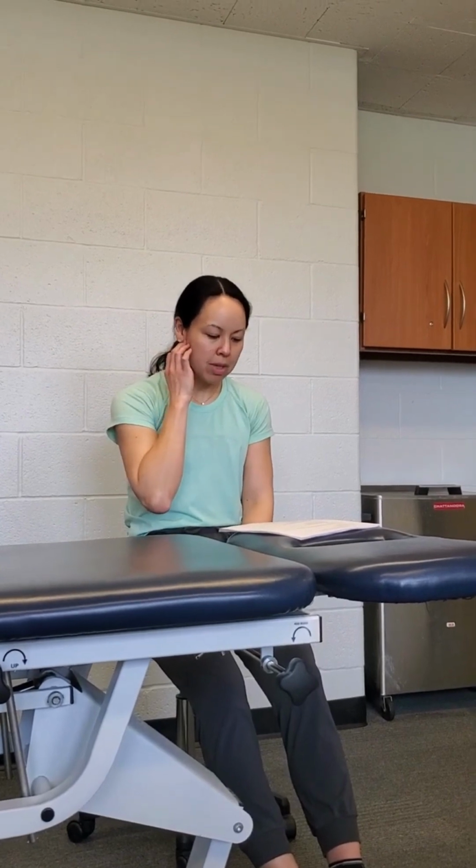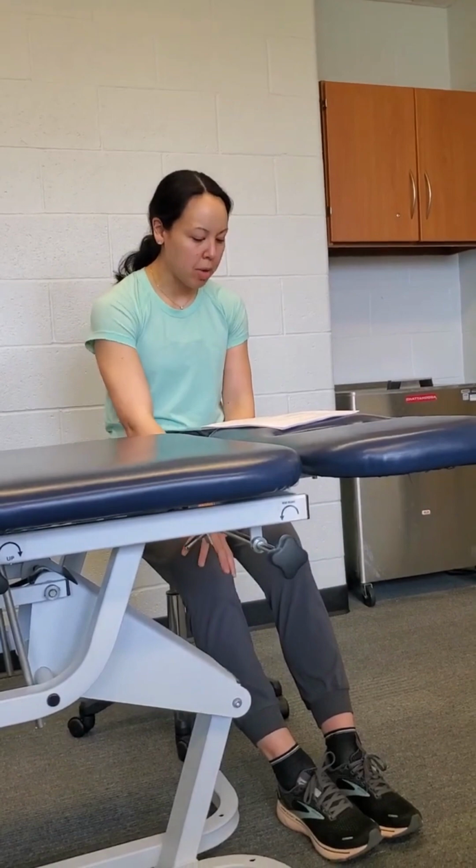For muscle strength and hypertrophy, so we're going to talk about what you are trying to achieve with using the BFR. For lower extremities, the limb occlusion pressure is going to be between 60 and 80%. And for upper, it's a little bit lighter at 50%. And you want to really use light loads at about 20 to 30% of their 1 rep max. So we'll talk about how to calculate that, or at least estimate it as a starting point, but certainly you may have to see how the patient's doing with a particular exercise and go down or go up, and we'll talk about that in a moment.